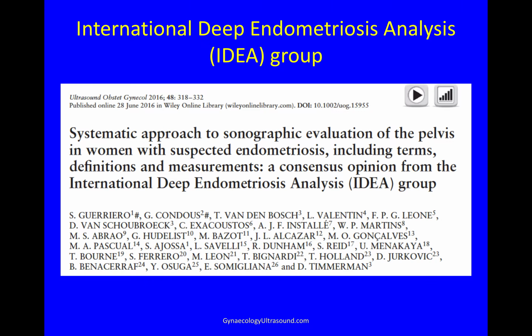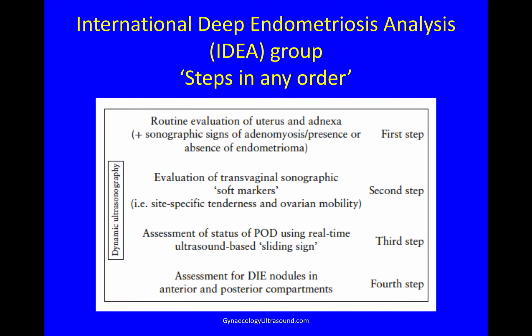In 2016, the International Deep Endometriosis Analysis Group published this paper, and it's a consensus opinion on terms, definitions, and measurements to diagnose endometriosis on pelvic ultrasound. They have defined this as being useful to do in 4 steps, and these can be done in any order.